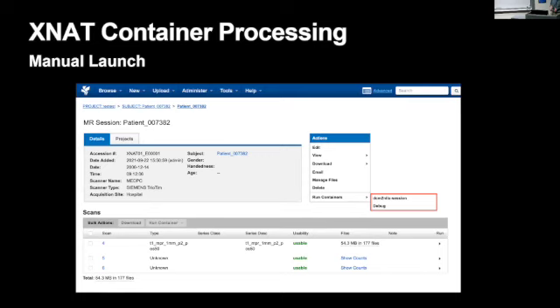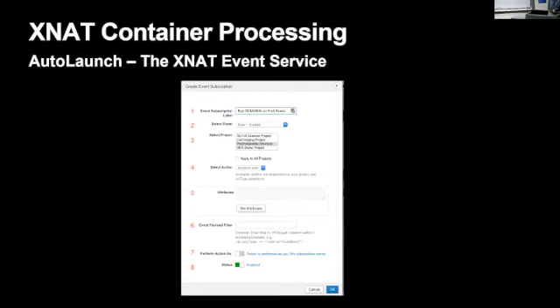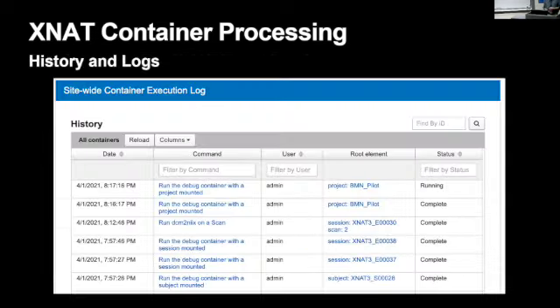The next screens show the process of doing a manual launch of the containers. Nothing that useful there. This more shows the setup for auto launching, where you can lock into specific events so that as sessions come in, if you want DICOM to NIFTI to run, or a face masking pipeline to run, you can configure that so containers run automatically as sessions come in.